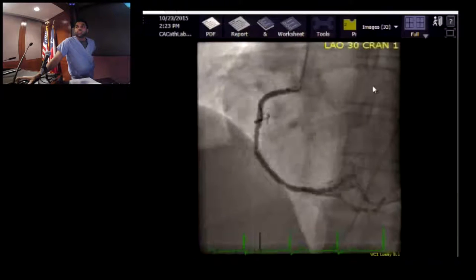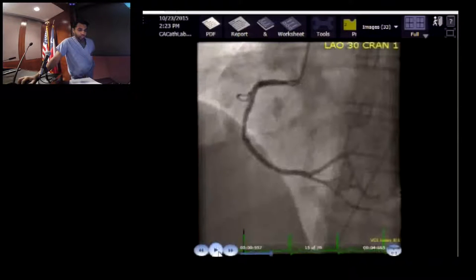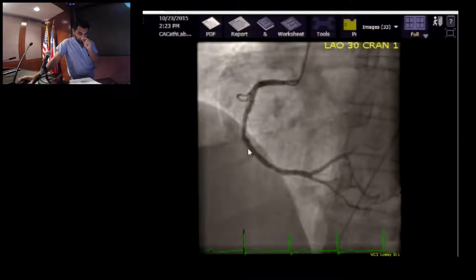Where is classically the AM? AM is right where you have the C loop. So that is the acute margin of the heart. So that's where the AM comes off. On the obtuse margin of the heart is an obtuse marginal, on the acute margin is the acute marginal, the large branch which will almost look parallel to the PDA most of the time. In this patient, unfortunately, we don't have a very big one, but in this case, I would use right where the RCA turns and dives back, that is the acute margin. Like that's right here. Where the branch will come. And the fourth segment of the RCA is the PDA.